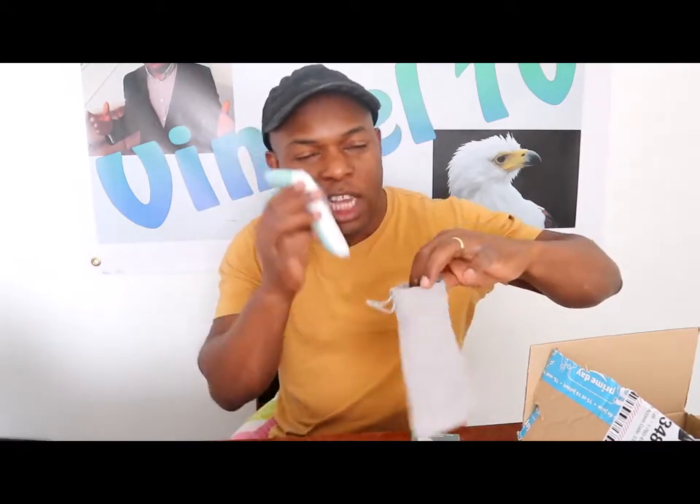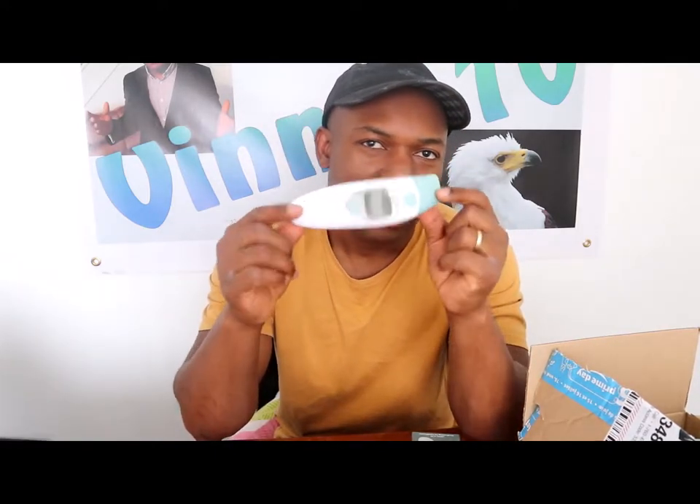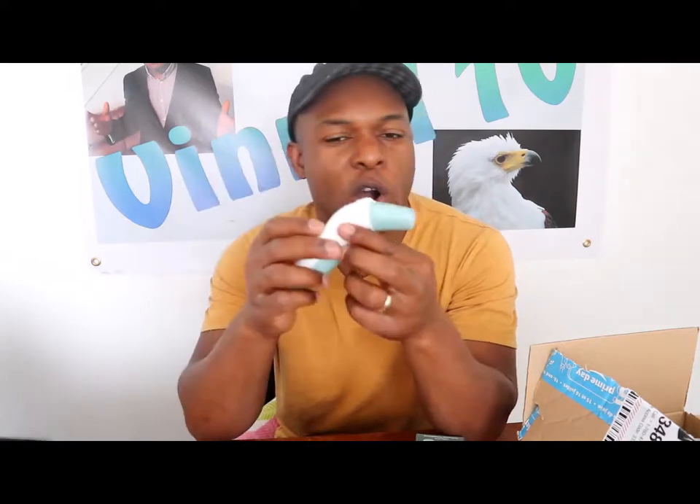Every family needs to have this at home, especially people with young kids who tend to have fevers. You need to have a thermometer in your home to monitor temperature. When your child has a fever you can give them paracetamol to bring the fever down, but most importantly you need to see a GP. This one has two functions — you can use it as a forehead gun or put a probe on and check it inside your ear.